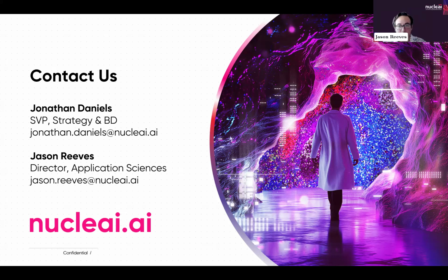So we routinely take in either 20x or 40x imaging samples, so we can work with either of those. One thing to note, obviously, is that certain models perform better with higher resolution. The more granular you want to get on segmenting certain cell types, you might want to consider working with a 40x scanner, but we can help provide guidance on that as we're scoping out the project with you. And if it's necessary to do some rescanning, we can help connect you with labs that can do that as well.